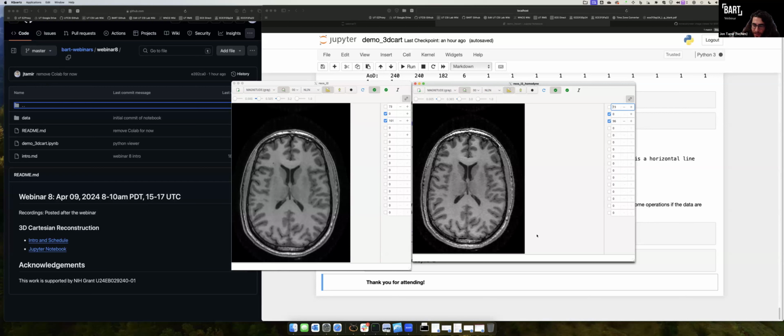And for that, we on the GE side, again, we have integration with Orchestra, which lets you put this reconstructed image back into the pipeline that will perform gradient nonlinearity correction, Fermi filtering, zero padding, put all of the orientation to be the correct orientations, resample if necessary, and then actually have DICOMs that are usable and comparable. So that'll be the topic of another day, as well as showing how to reduce some of the extra unneeded steps if you're going to go ahead and do that.